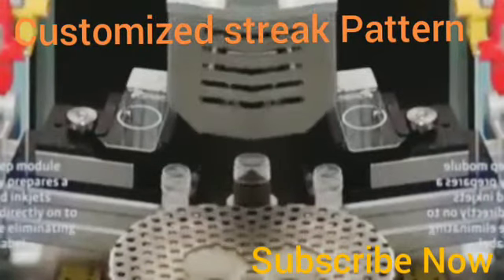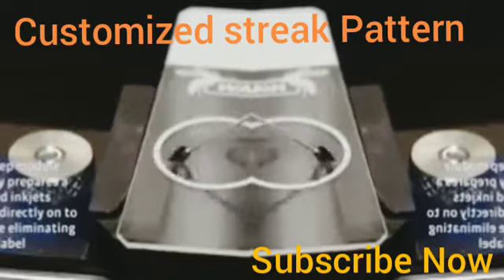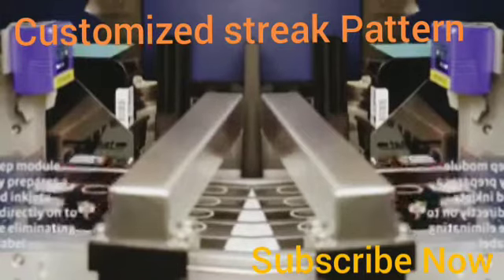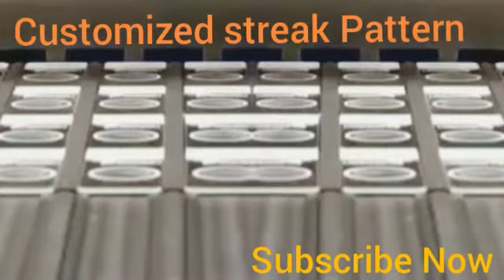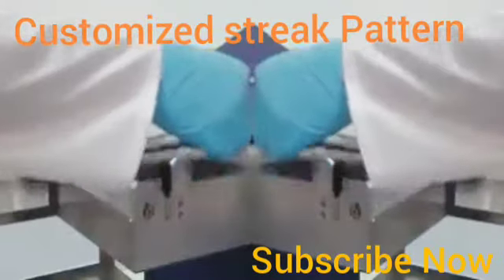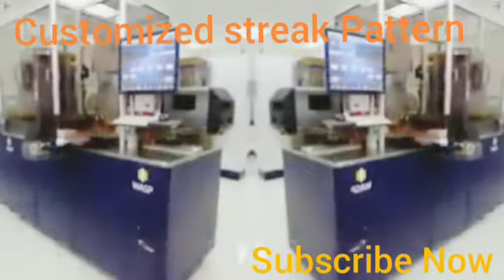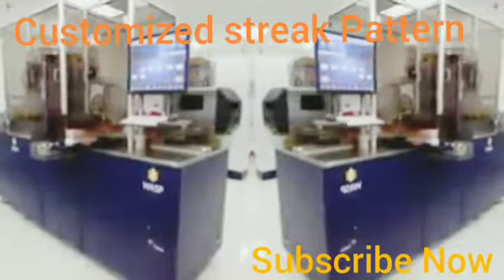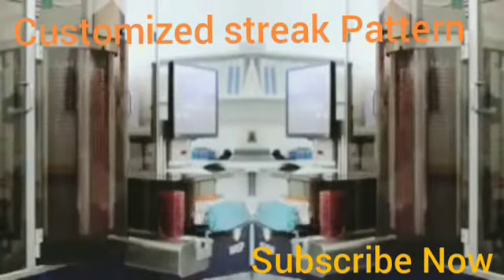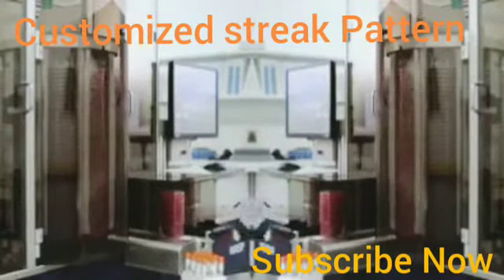The gram slide prep module automatically prepares a gram slide and inkjets patient data directly onto the glass slide, eliminating the need for label. After processing, samples and plates are offloaded from the front of the instrument.